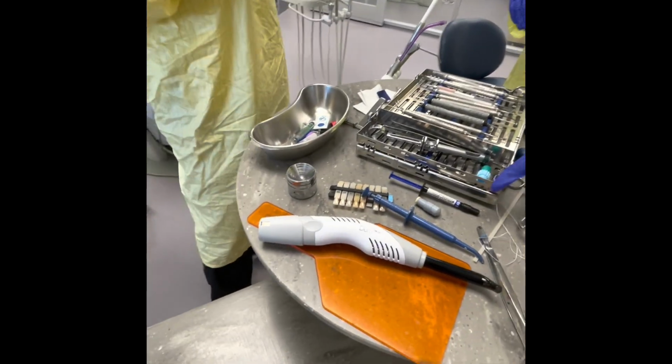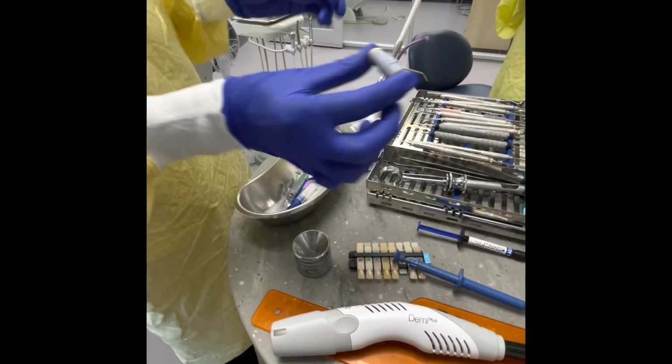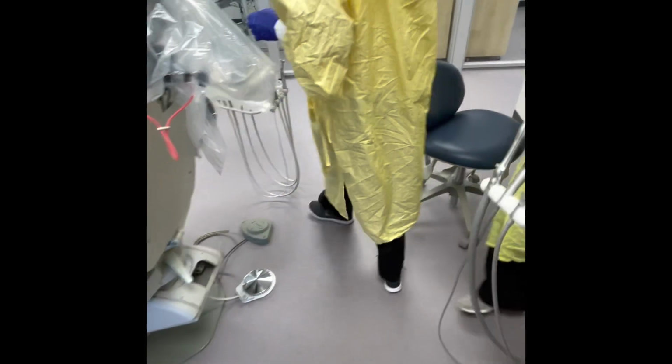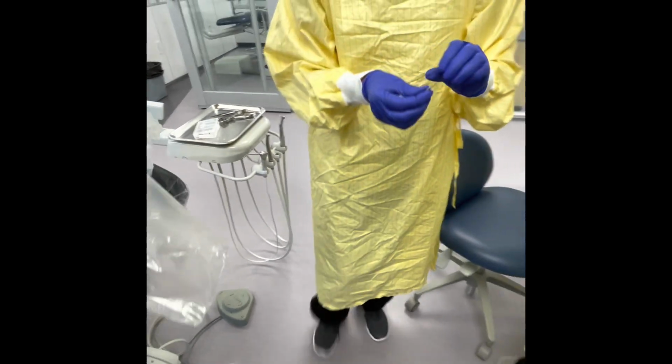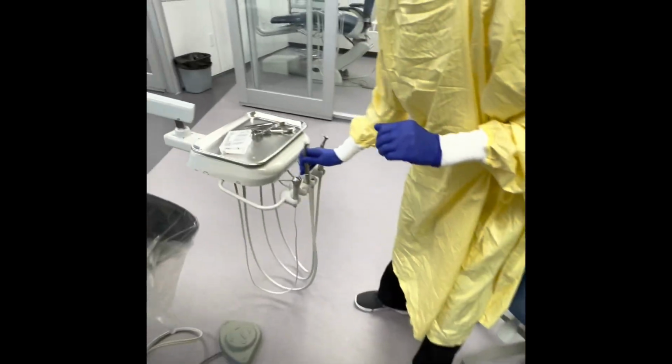Lastly, I'm going to come over to my hand pieces. My amalgam capsule will go in there as well. And remove the burrs. Okay, so Amanda has 2 burrs out. I'm going to safely put them in here. And then I'm going to remove the burrs in the hand pieces.